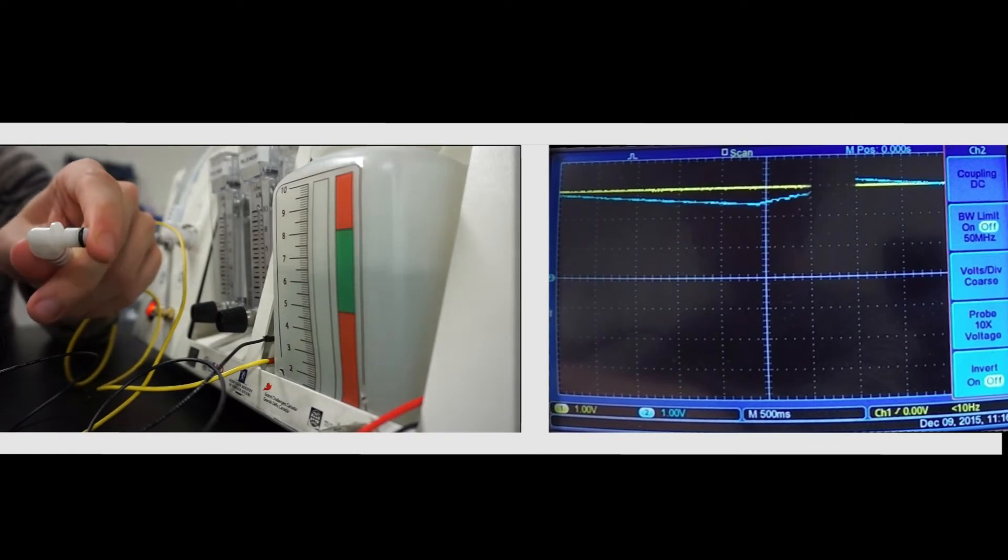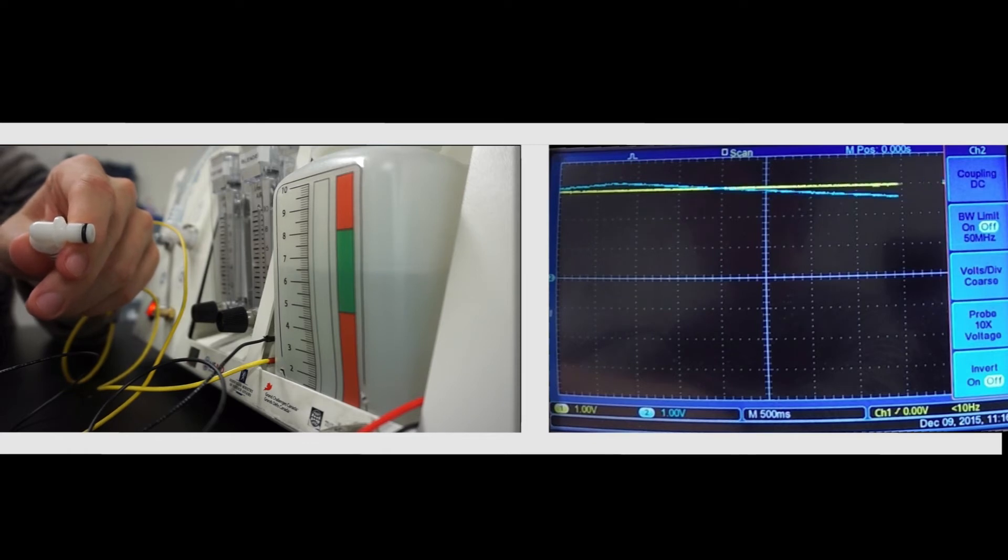The blue line on the right shows the output of the analog front end, which increases when bubbling occurs. When that output falls below a reference voltage set by us, represented by the yellow line, the alarm is triggered after a short delay.